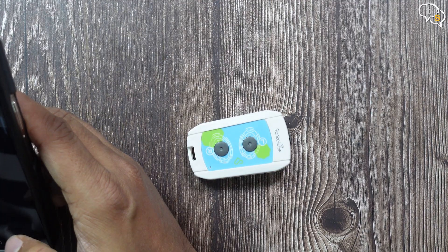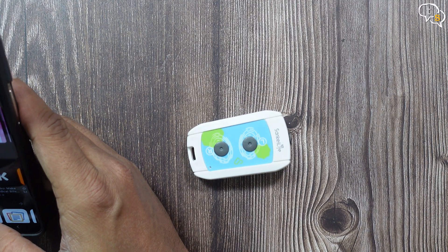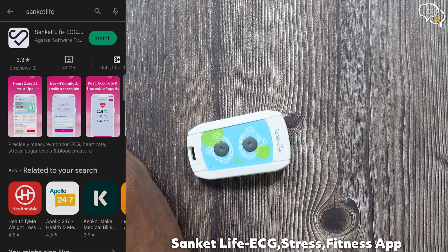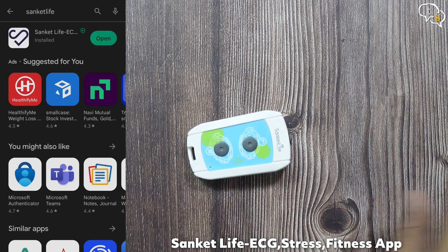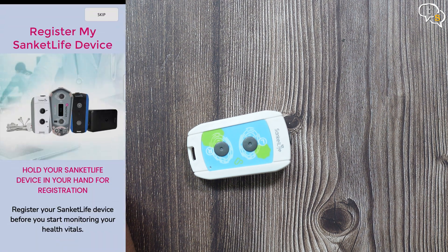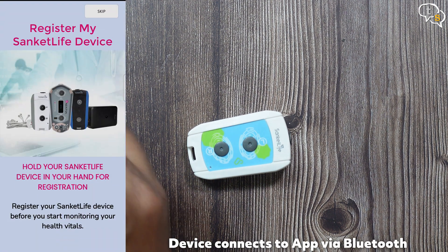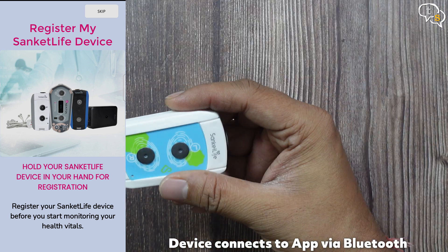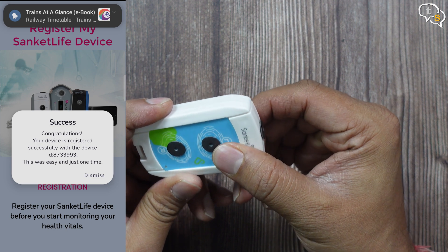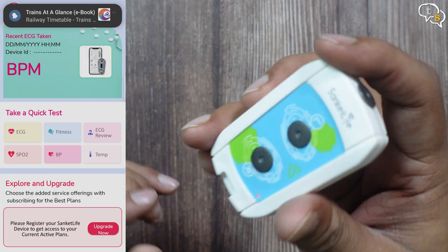Now for the app. Use the QR code or search the Sanket Life app on the app store or play store. This is the one, Sanket Life ECG. Sign up for an account and login. Once in, we have a notification to register our device. So turn on Bluetooth on your phone and also turn the device on using the button below. We have a red light here. Sanket 2AD, device was found and we get a success message on screen.